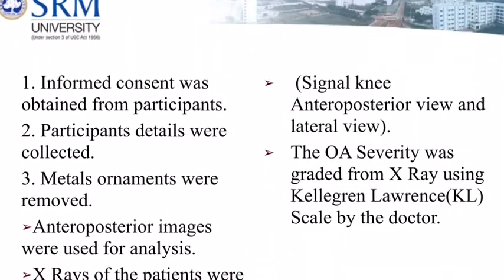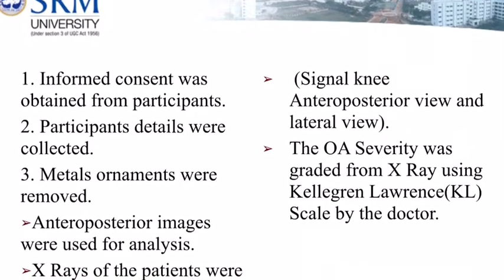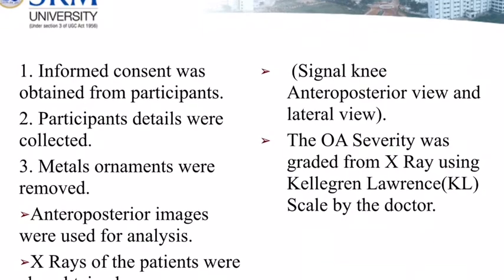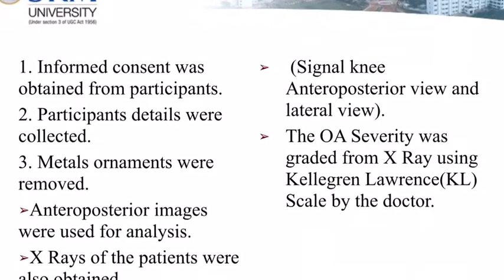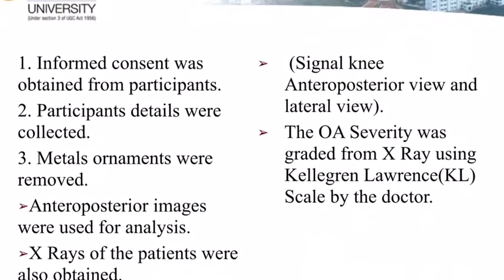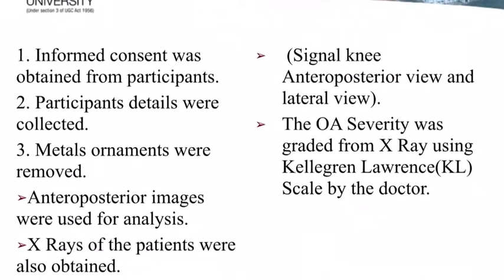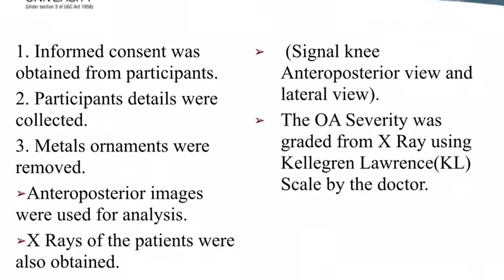Informed consent was obtained from the participants and their details were collected. The metal ornaments of the participants were removed. The knee X-rays of the knee osteoarthritic patients were obtained for validating the presence of osteoarthritis, and the severity of the osteoarthritis is graded from the X-ray using the Kellgren-Lawrence grading scale by the doctor.